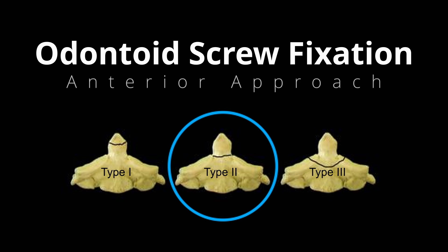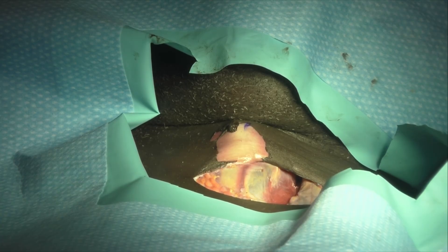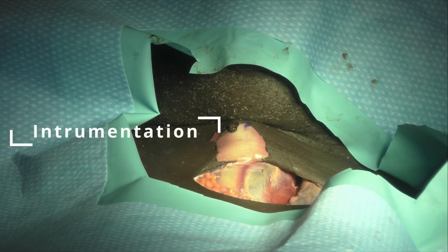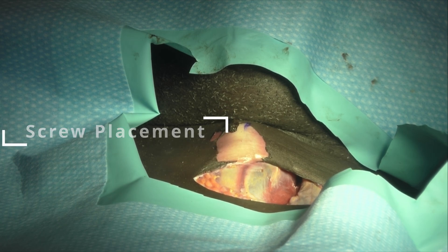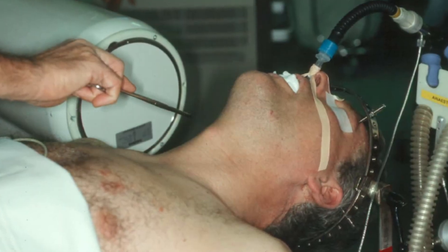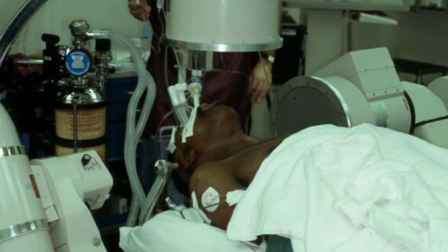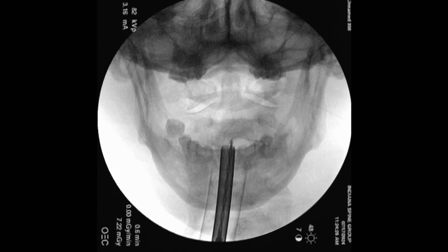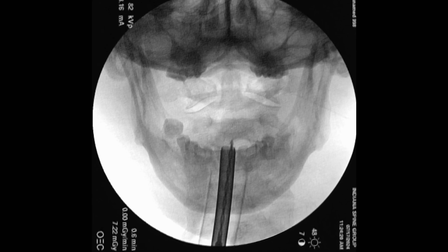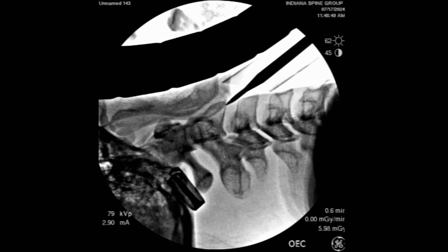Today we are going to be talking about odontoid screw fixation through the anterior approach for a type 2 odontoid fracture of appropriate morphology. We have the specimen, and we're going to be showing the setup, the instrumentation, and placement of a fully threaded screw using a lagging-by technique. The most important part about placement of an odontoid screw is positioning and the ability to obtain appropriate imaging — without that, this is not a safe procedure.